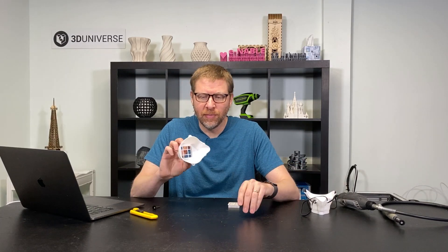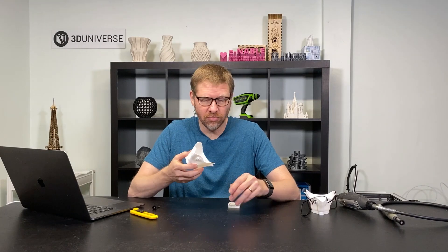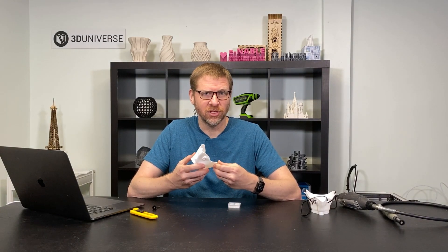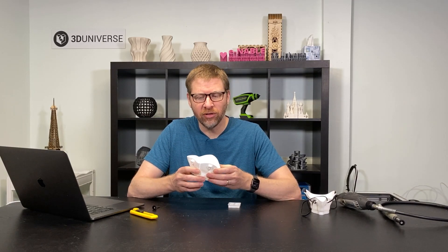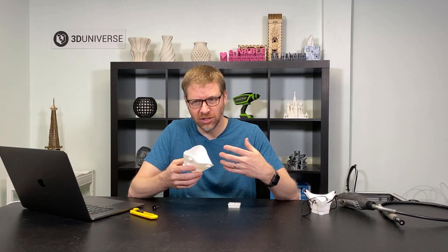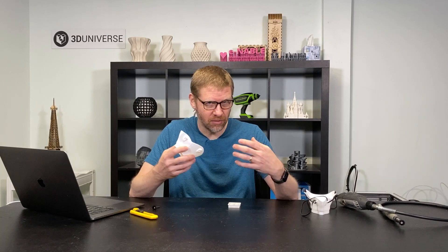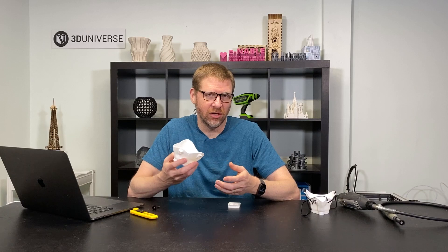The first thing to understand is that this mask itself is designed to be printed in TPU, which is a flexible material. TPU is a lot more challenging to print than other materials like PLA or PETG. Because it's a flexible material, it has a tendency to get jammed more easily. Sometimes it gets bunched up in the Bowden tube if you have a printer that feeds the material from the back. So there are some challenges.